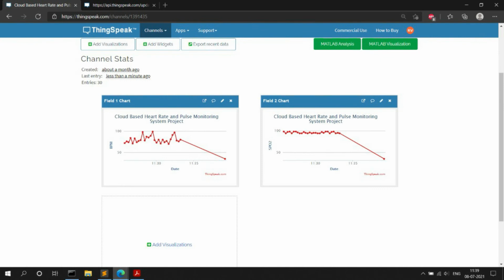As you can see, we have passed the low value, in this case 30, to both of the charts, and this leads to the value getting reduced drastically, and in this case an alert is triggered for both blood oxygen as well as pulse. We should be expecting an email now, and this is what we get. I'll show that next.